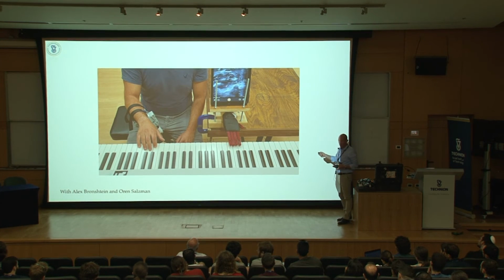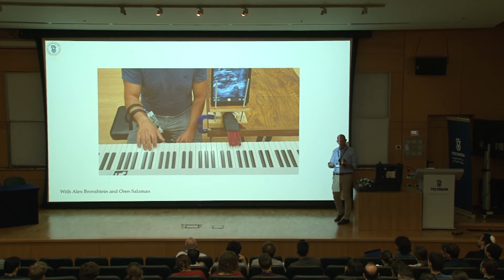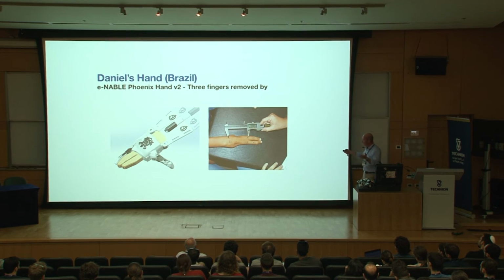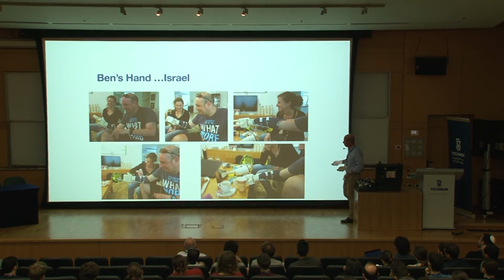So, in real time, analyzing the ultrasound and then operating the hand. So this is another project, a collaboration between computer science and mechanical engineers. The hands were given to many children around the world. As you can see here, some of the prototypes.